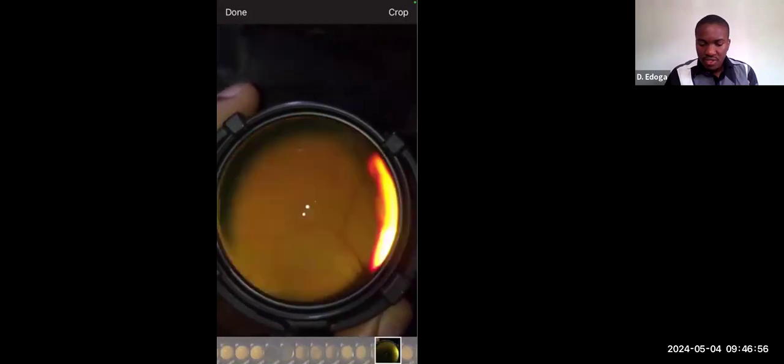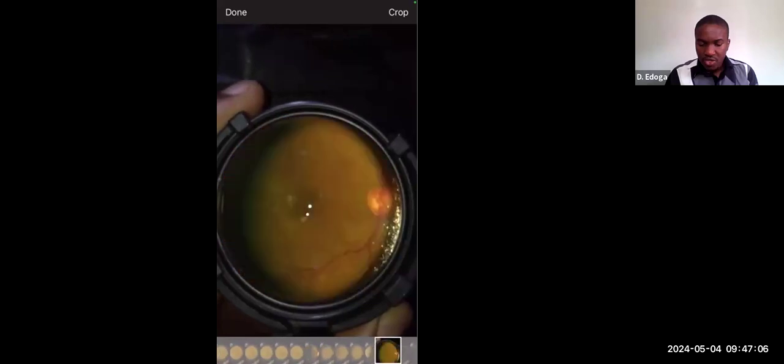By compressing this video, it's going to make this video lose quality. So it's one of the things I'm going to raise with Dr. Michael Ullman, to see how we can not compress this video so that it will retain its quality. So you now move this slider that is below. You slide it until you get a very good image that you are comfortable with. When you get to the end of this, you can move it to the left. So the idea is for you to be moving this until you get a view that you're comfortable with, for you to now apply a mask.